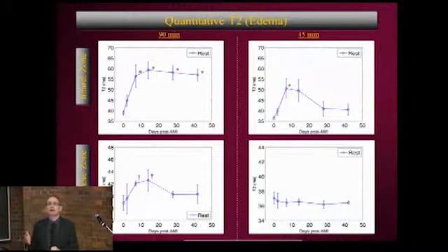It's interesting that even away from the infarct, in the so-called healthy tissue, you also see in these severe infarcts an edematous response. This is something interesting because remember that remodeling, that adverse remodeling and diastolic change in volume is actually something that's going on in the remote myocardium away from the infarct. So perhaps this is now giving us some insight that the fact that there does seem to be an edematous response in severe ischemic events, even in the remote zone, may be predictive of the damage going on in the remote zone. Whereas in those less severe infarcts, you do get an acute inflammatory response.